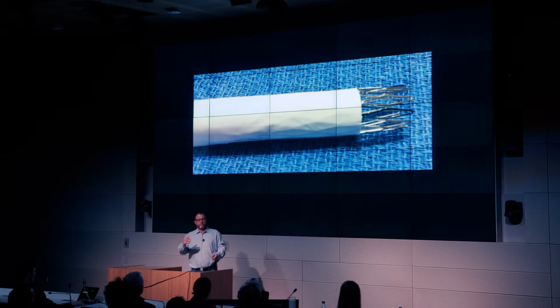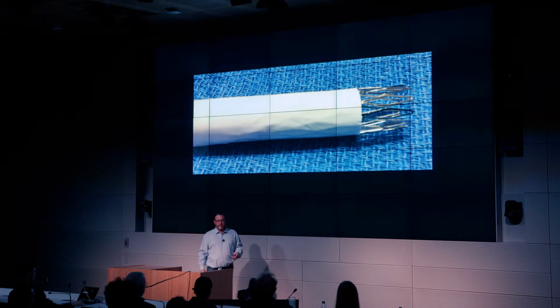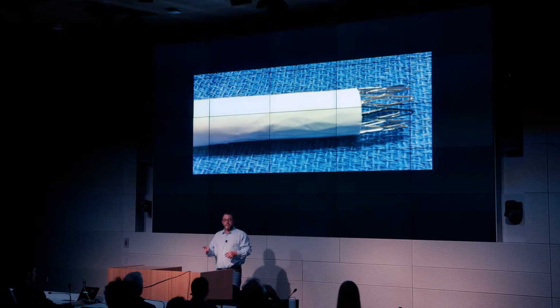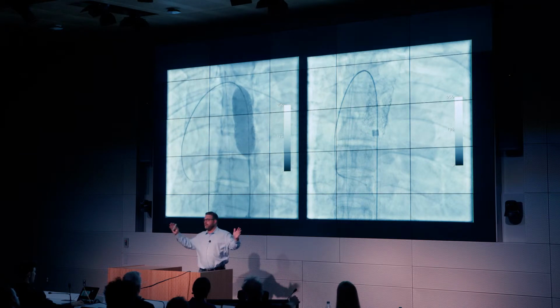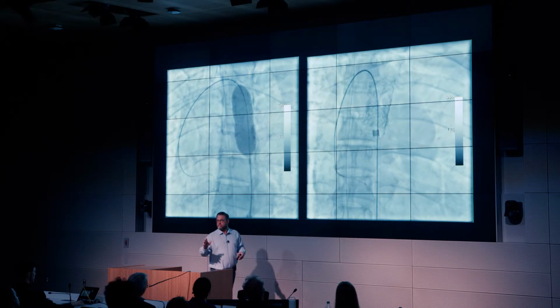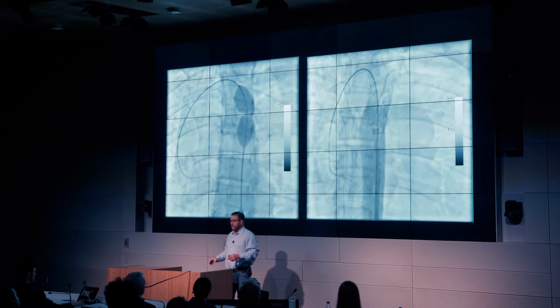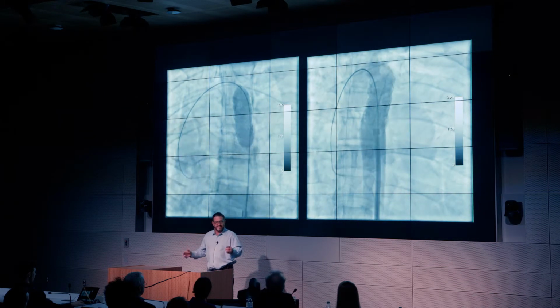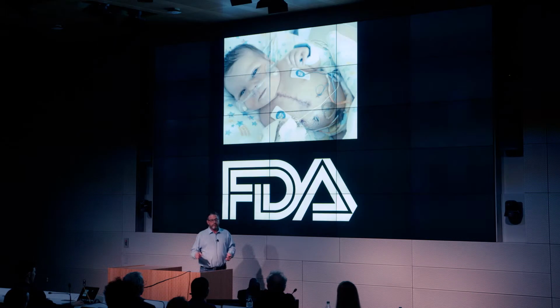Fortunately, we had the foresight to make kind of an internal Band-Aid. This is something called a covered stent, and this is the actual device that I had in the lab. I basically took Gore-Tex, and if you look really closely, we sutured it onto a stent. Then we mounted that stent on the balloon, the heart still stopped, and we deployed that stent as an internal Band-Aid for this ruptured aorta, with continued chest compressions. Once that stent was in, this aorta was patched up, we were able to transfuse this girl back with blood and get her heart started again. We were super worried about her, and we woke her up and said, hey, move your left hand, move your right hand. And she goes, hey, what do you know? I feel great. So it turned out real well, but it almost didn't turn out well.